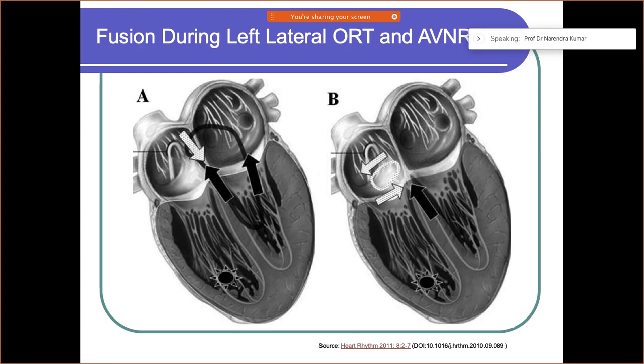Because the ventricles are part of the tachycardia circuit in orthodromic reentrant tachycardia, the tachycardia must be reset coincident with or before the first beat with a stable QRS morphology. In AVNRT, the first beat of stable morphology, which is the end of the transition zone, is fully paced but does not reset the tachycardia circuit.